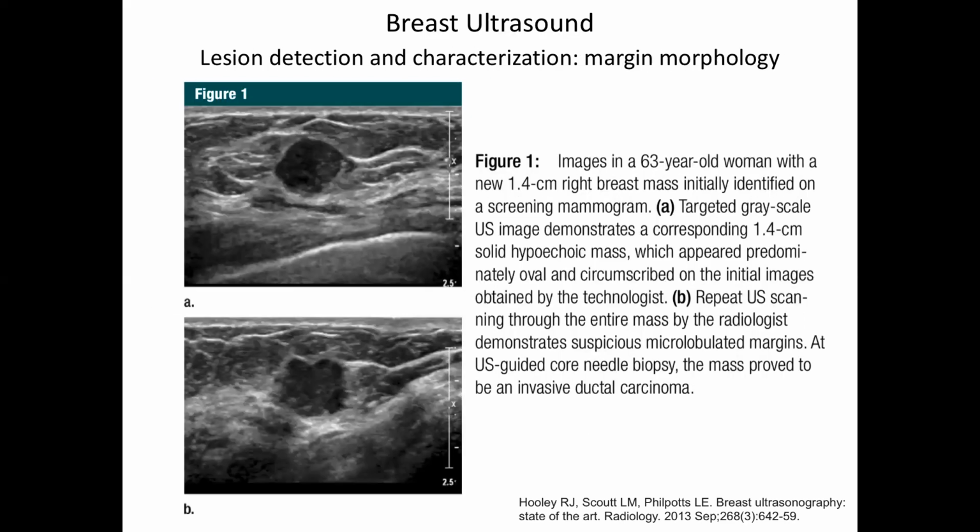Yeah, sure. That's a great question. So the question is, why does it show up as a dark spot? Why isn't it a bright spot? And for whatever reason, the internal structure of the tissue here is obviously a lot more homogeneous than the internal structure of this tissue.